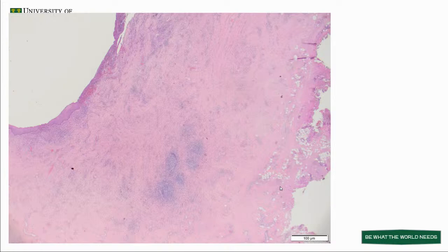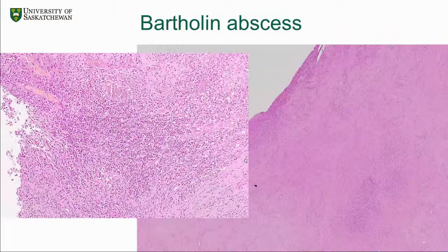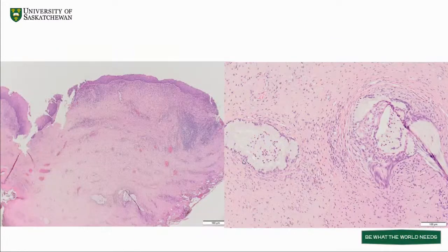You're seeing this non-specific epithelial layer here, and then you're seeing the acute and chronic inflammation, and you're like, well, done and dusted, that's my job. But you really have to think not just about the abscess, but about looking for that Bartholin's gland. It can be a bit of a treasure hunt to find where the Bartholin's gland is. There will be clues to where it is in the clinical history, but to say a Bartholin's gland cyst, you want to be able to at least identify the Bartholin's gland.